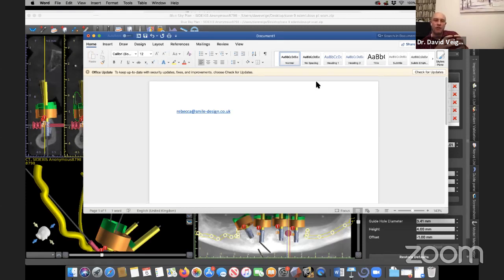And it will do two things. It's going to expand and push the bone, hopefully compacting it and creating a greater density, and you're going to get much better primary fixation of the implant. One thing you have to be really careful of is that you don't provide so much pressure that you create a pressure necrosis in the bone, which will reduce your integration rate. So as I introduce the implant, I back it out, introduce it and back it out again, expanding and contracting, allowing the bone to be manipulated around the implant.